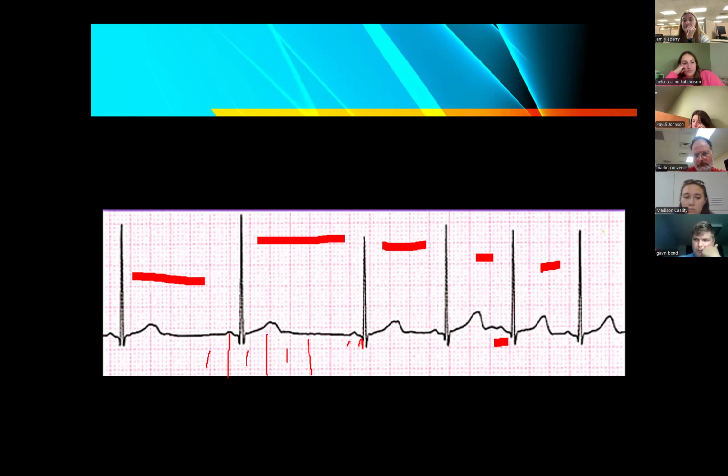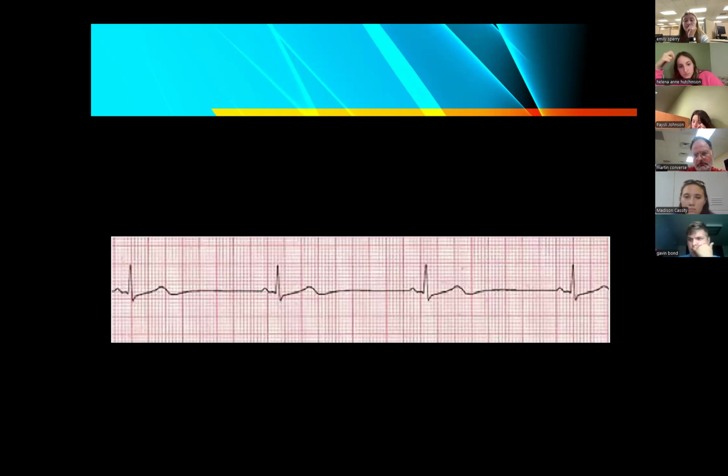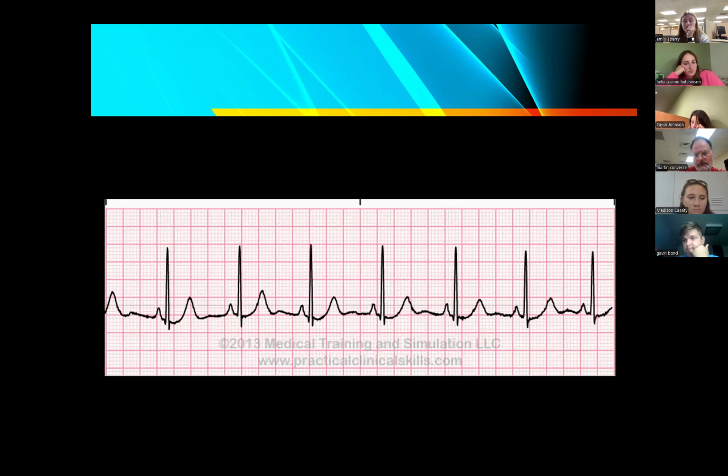Excellent question. Madison, I'm going to skip this one because I think this is the very one that Marty had a while ago. Let's go with this one. Again, what is the rate that you see here on this EKG, Madison? 70. Excellent. Very, very good. Why is it not 80? Because the first one doesn't have a QRS. I love being around smart people. Excellent. Rhythm.